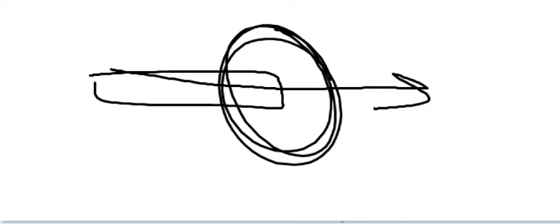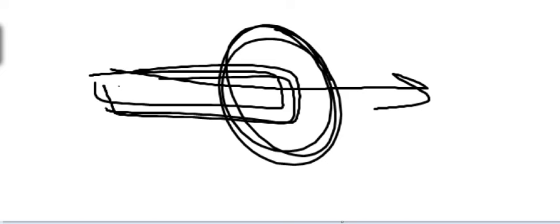After the acquisition, we have the whole patient imaged, or let's say the whole part, for example the whole chest. Then we can tell the computer to make slices that are 5 millimeter thick, 10 millimeter thick, 6 millimeter thick. I can change it to any slice thickness I like, because I have all the data, continuous. Nothing is missed. After the acquisition, this is called the raw data. Then you can tell the computer to make 5 millimeter slices, 10 millimeter slices, 2 millimeter slices, as you like.